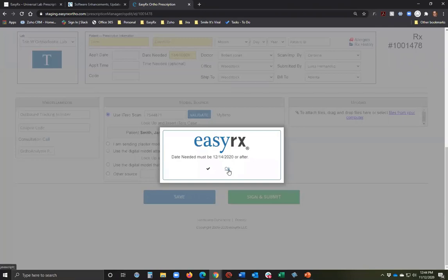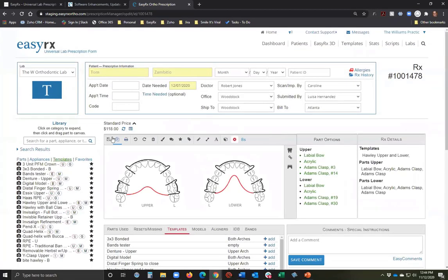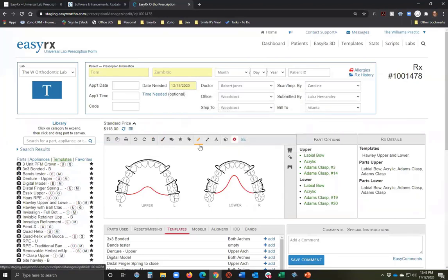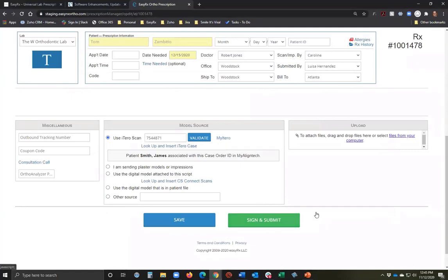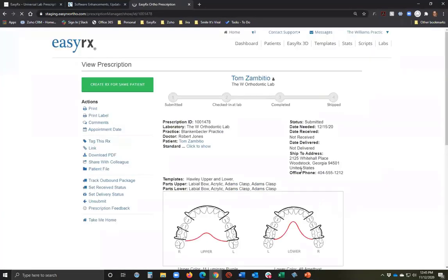Before I sign and submit, I note that the lab has a minimum turnaround time set up. Also, if you're using the management product, you can enter standard pricing so the practice sees the standard price for all parts on the prescription as they're creating it. Now I'll sign and submit — the case is now submitted to W Lab.